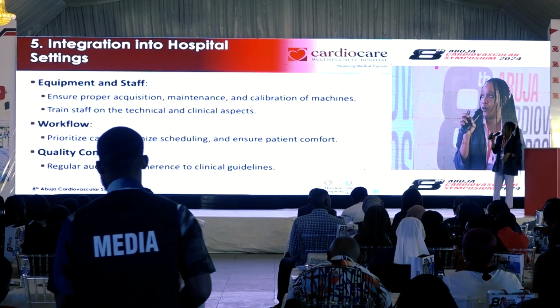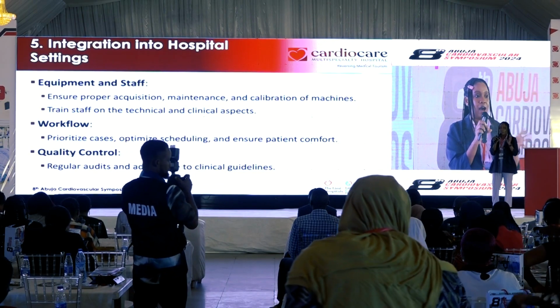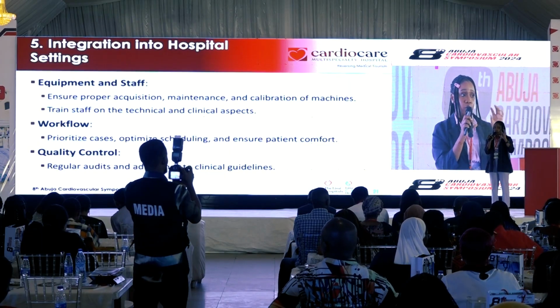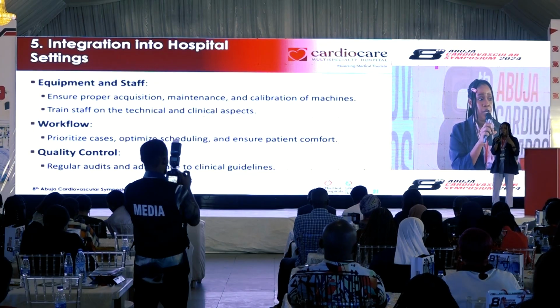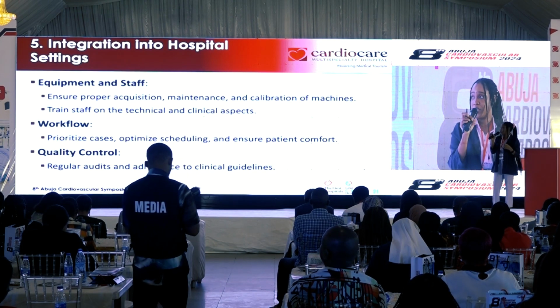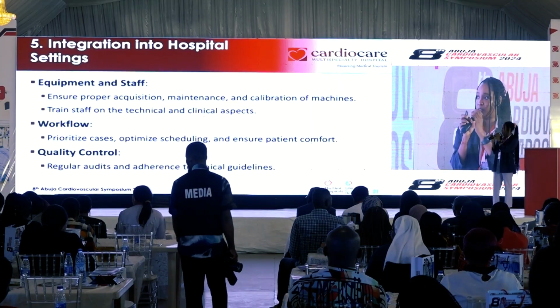So for integration in hospital settings, ensure proper acquisition, maintenance, and calibration of all these machines. You cannot have these machines and keep them carelessly. It will result in you buying and buying and buying. That's why, once you have these devices in your facility, you should clean them properly after use to avoid rusting and spoiling. It even helps in reducing artifacts, because just imagine your ECG wires are tangled and you're trying to do an ECG. Then you're complaining, I cannot even interpret this, meanwhile you're not the one keeping it well. So you have to keep all these devices very well.